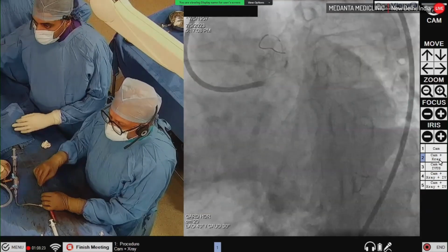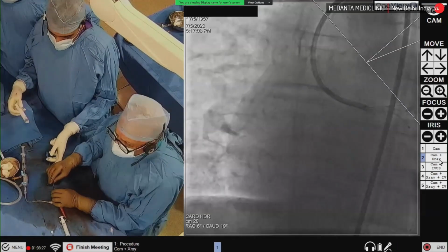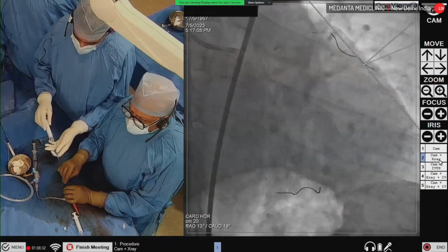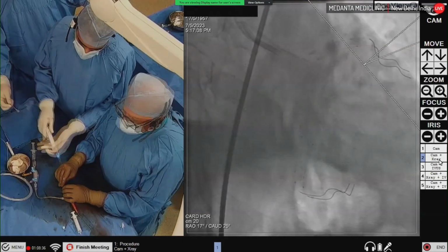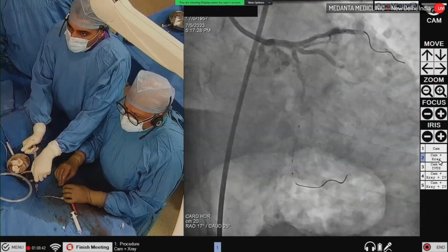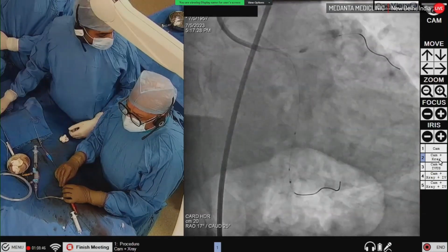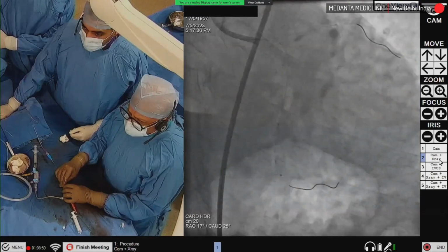Okay, come to RAO caudal. Okay. Check please. Yes. Go up. 1, 2, 3, 4, 5, 6.